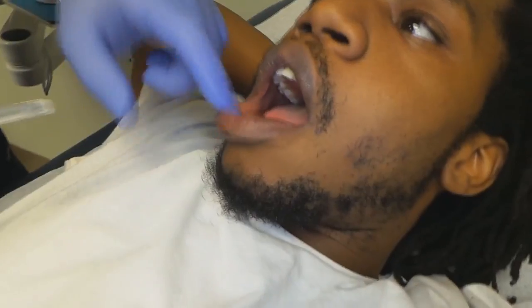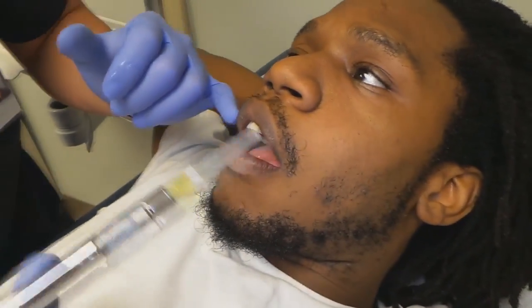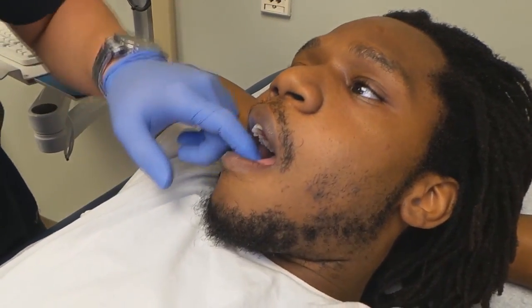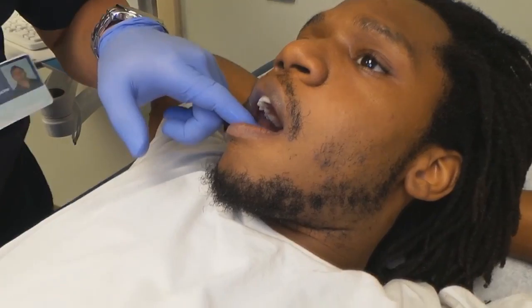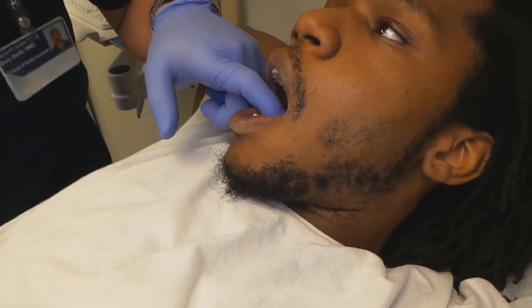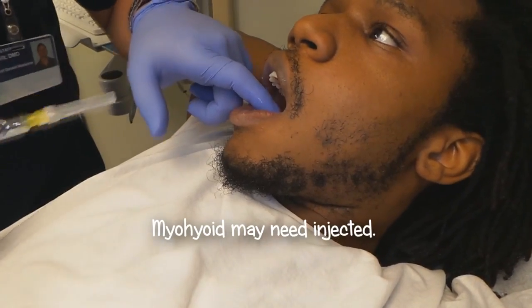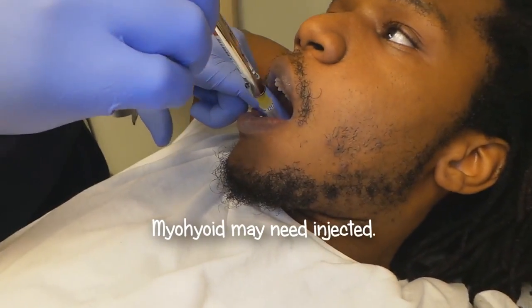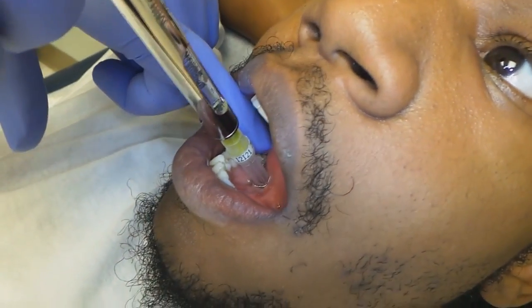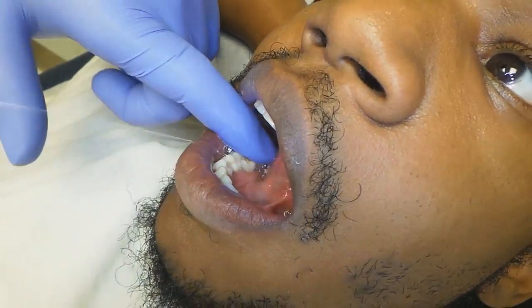For the upper, every time you infiltrate it will get the mucosa on the outside too, so only in the mandible do you have to do the long buccal. Rarely — hypothetically, if you can't get a patient numb — sometimes it's the mylohyoid. Very rarely, about 2% of patients have innervation from the mylohyoid. You're just going to take the needle, drop it straight down to the floor of the mouth, aspirate to check for positive aspiration, and then deposit a little anesthetic.